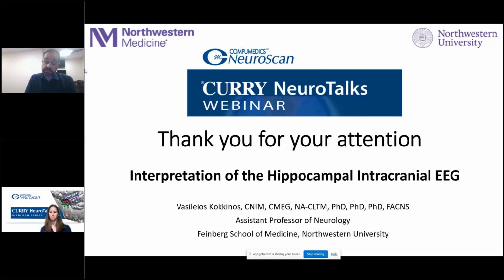because it's deep, it's mesial, and sometimes that signal may not be picked up on the non-invasive EEG of the presurgical evaluation. So the hippocampus might be involved, but this would not be apparent on the EEG. So the thought is let's implant the hippocampus, even though it's not in the hypothesis, just in case it is involved, and we can address this with an anterior temporal lobectomy.